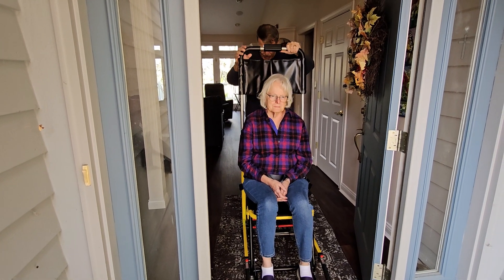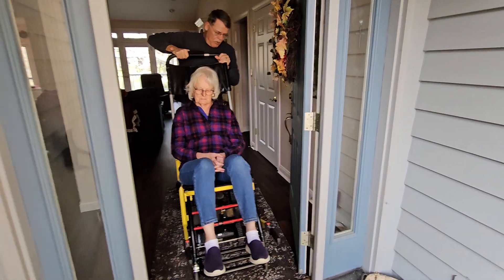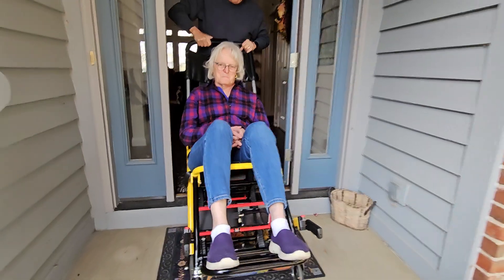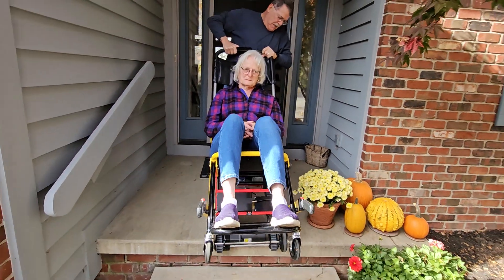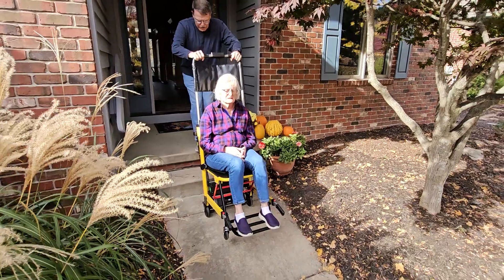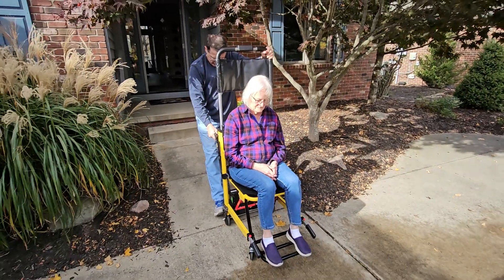So we'll get back into the chair, we'll come up near the steps, I'll tilt back, and then we will move towards that first step and continue down the other steps fairly smoothly, down to the base. We'll gently set you down, and then we can wheel you back directly to the car door and put you into the car.